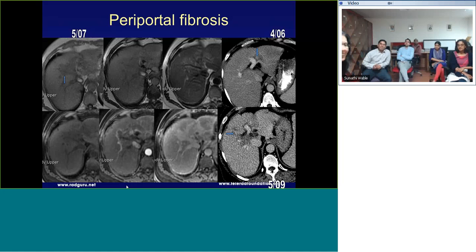But we did think about it, and we said, let's follow up, and we also want to see if the AFPs are rising. But anyway, just to show you all these nuances, all these other disease processes that can occur and kind of throw you off.